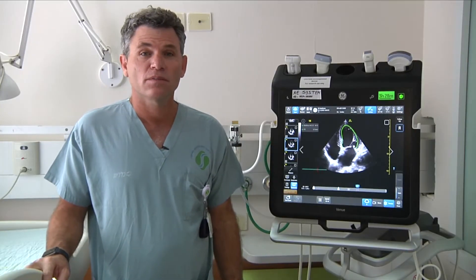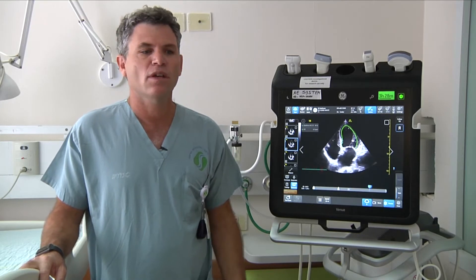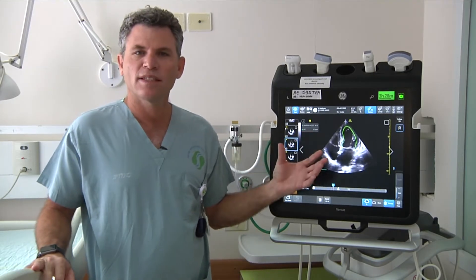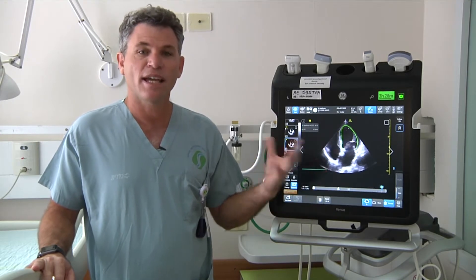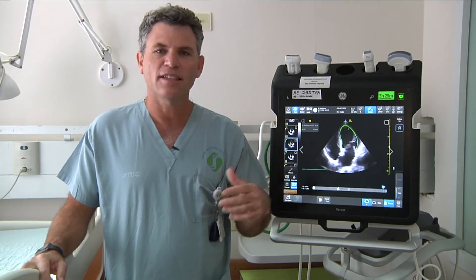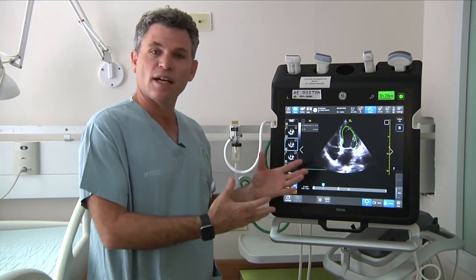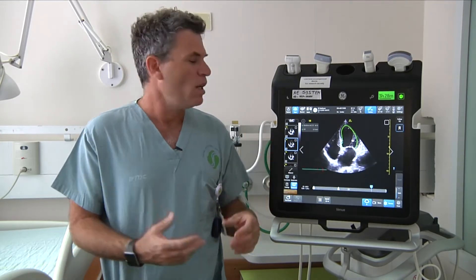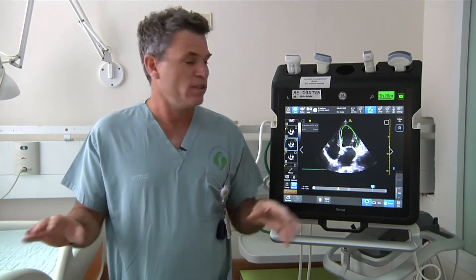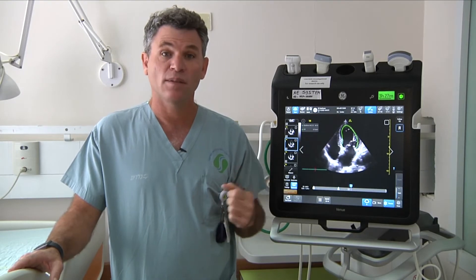As you can see here, we have a quality indicator that's actually very, very helpful for novice operators who don't have the confidence that they have the right assessment, the right alignment. We have a traffic light indicator — red, yellow, and green — that in real time helps the performer make the picture better. When the novice operator sees a green light, they know the alignment is good and they can take a nice assessment of the real-time EF.